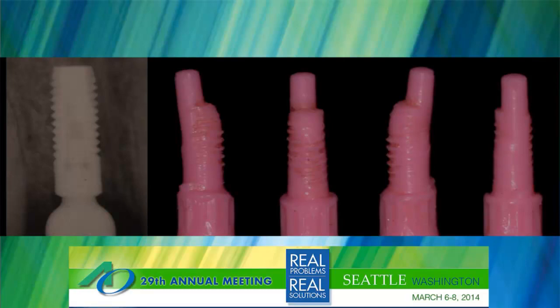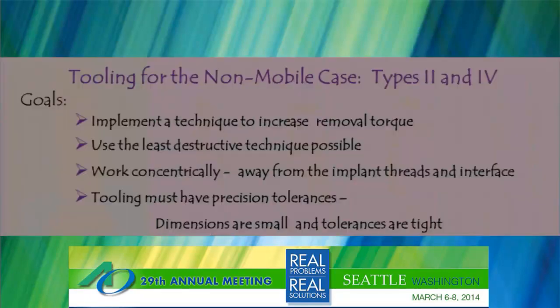And you can see what a fragment fork can do introduced into an implant, just like in Robert's case, but this one's worse. There's very, very significant damage to this implant. I don't know what happened. I have a feeling the implant was explanted. Could it have been recovered? Possibly with enough effort, but that's a decision you have to make at that point in time.